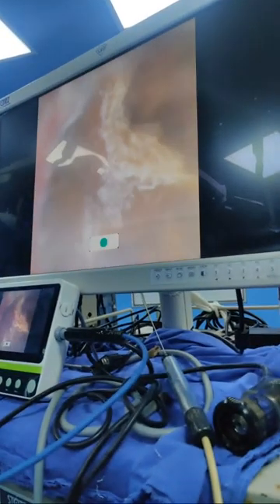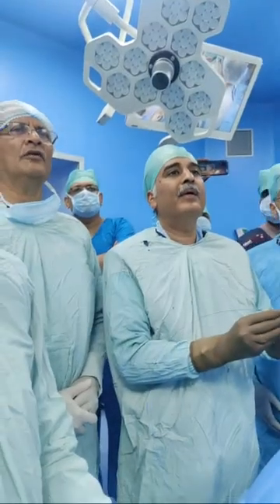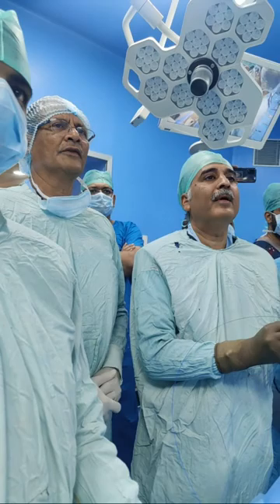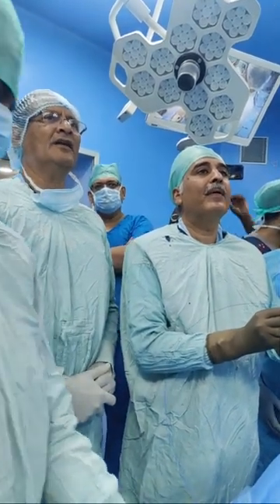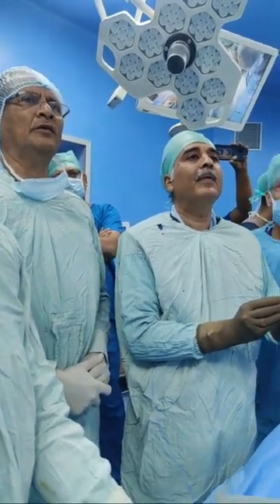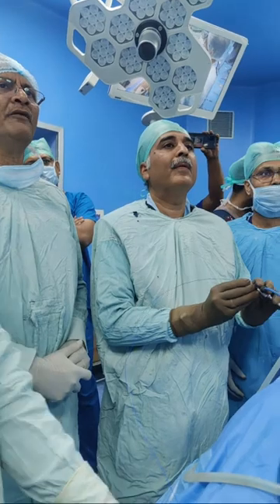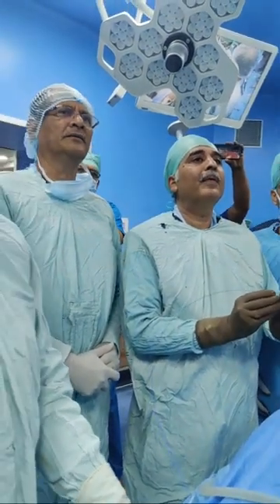There is no extra bleeding, so the extra complication because of the length of the time is not relevant when you are using active suction. And the lithotripsy time is fast. We save the time on removal of the fragment because it is continuously coming out, and therefore overall operating time reduces significantly, with the comfort of the surgeon.